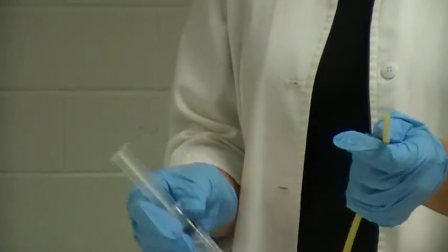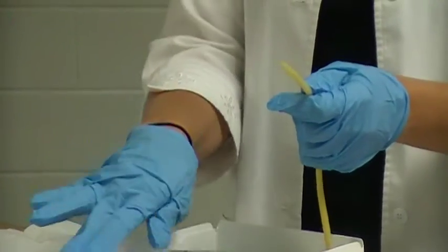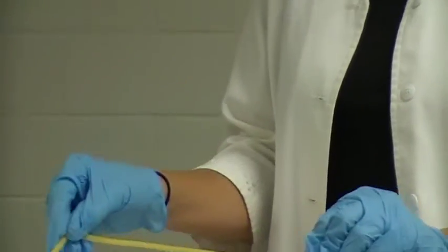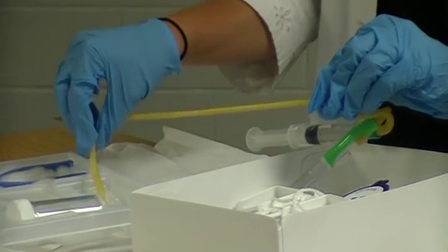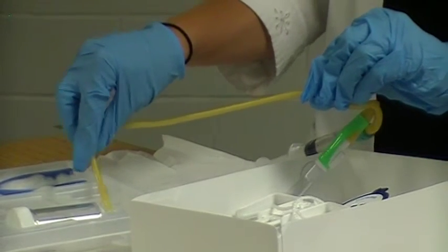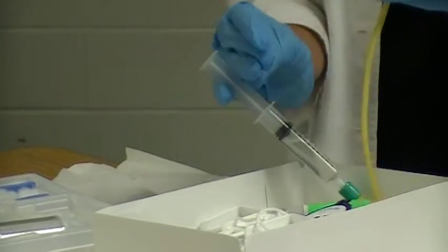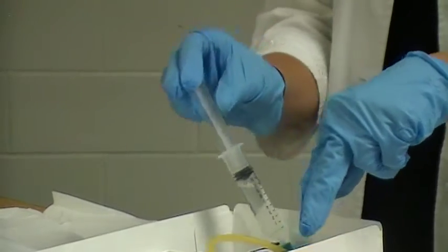Keep the syringe attached so it's ready when you insert the catheter. Without crossing over the sterile field, take the catheter tip and lubricate it. For a female, lubricate about one to two inches of the tip. For a male, lubricate about five to seven inches due to anatomy. Lubrication reduces friction as the catheter passes through the urethra. Then coil the catheter back into the box so it's ready to use.